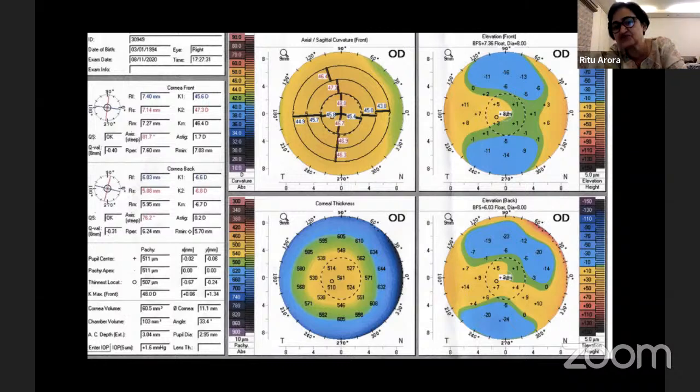So it is not something that we can ignore. Yes, ma'am. Okay, so it becomes important, and this elevation map is heightening it. Yes, ma'am. The elevation map is basically comparing the patient's anterior surface with the normalized surface. This is the normal, and this is the patient's. So this part is looking depressed, and the central portion is in contact with the normal.